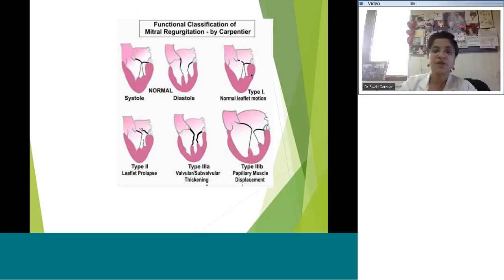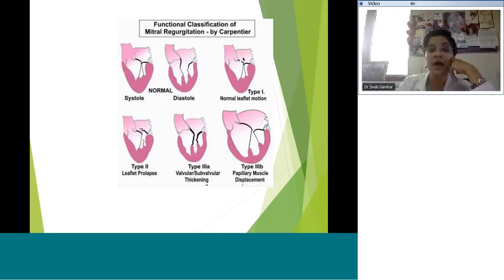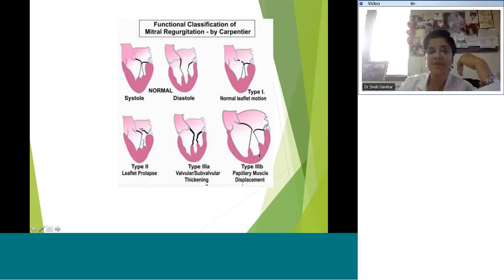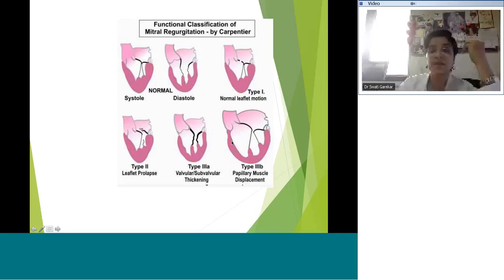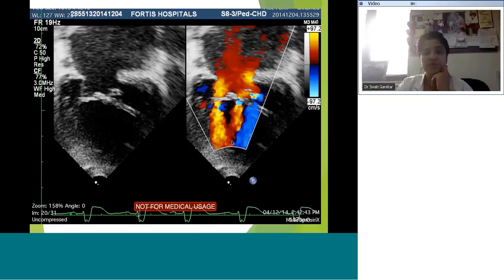Let's look at the Carpentier classification, which can be used for mitral or tricuspid regurgitation. There are three types. Type 1: leaflet motion is normal but either the annulus is dilated or there's a perforation in the leaflet — in this case there was a perforation picked up on transthoracic echo, and it was successfully repaired surgically. Type 2: excessive leaflet motion due to prolapse. Type 3: restricted leaflet motion — for example, an immobile posterior leaflet or displaced papillary muscles due to a very large LV. This classification forces us to think about the mechanism of the MR rather than just describing it.